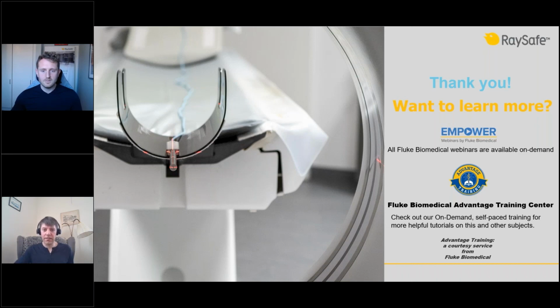In that case, you can calculate how many microgray per mAs you could expect. However, it's not giving you exact numbers. It's not something I can do on the fly. But the SpecCalc program is something that I have used quite a lot, and it's free for academic use. So you could do that yourself.